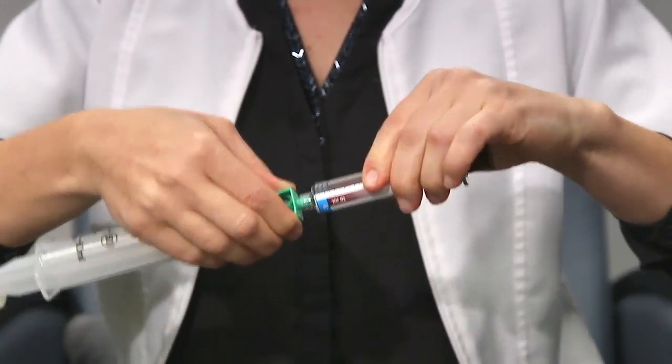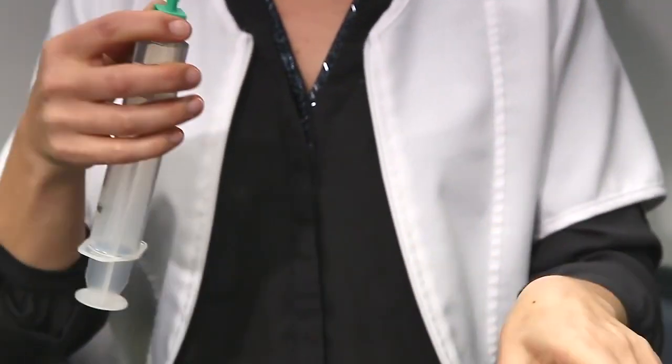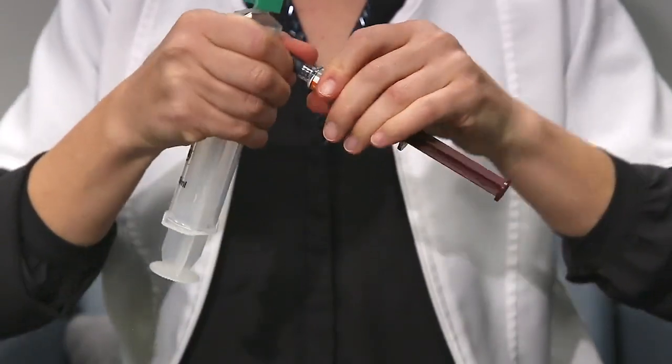Push on the plunger of the pre-filled syringe to transfer the immunoglobulins. Repeat the transfer steps to achieve your dose of immunoglobulins.